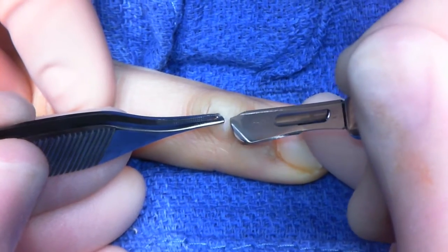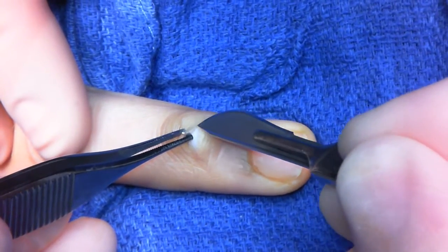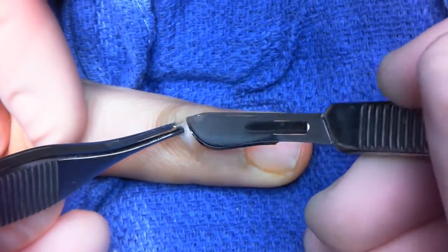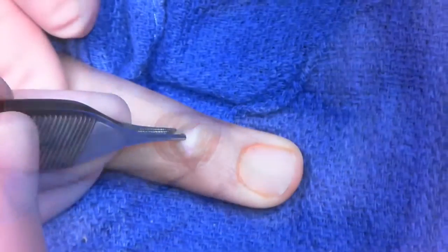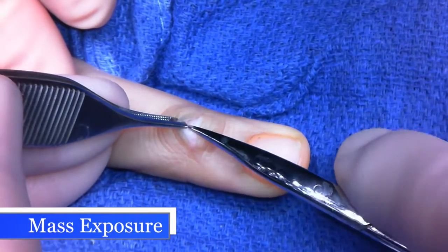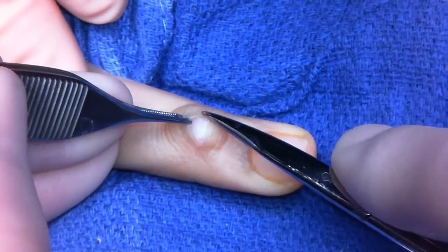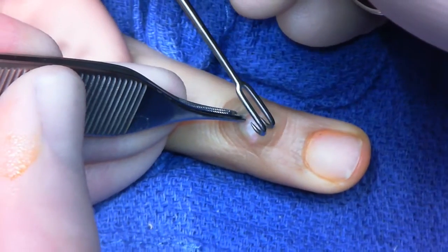You can see here I'm incising the skin over the mass sharply. Now I'm reflecting the flaps. A small skin hook is placed.